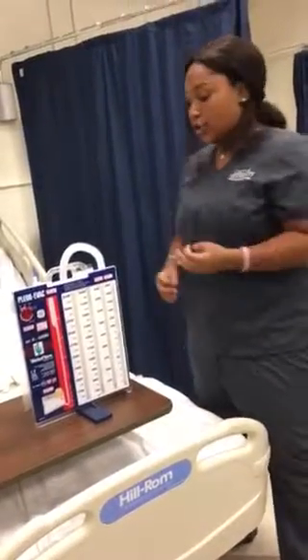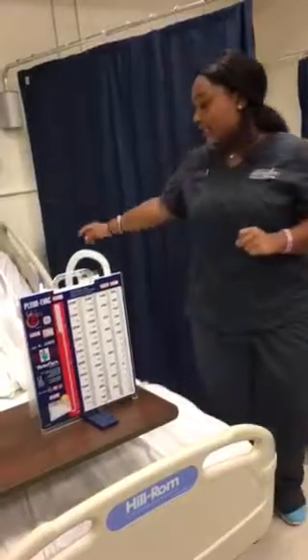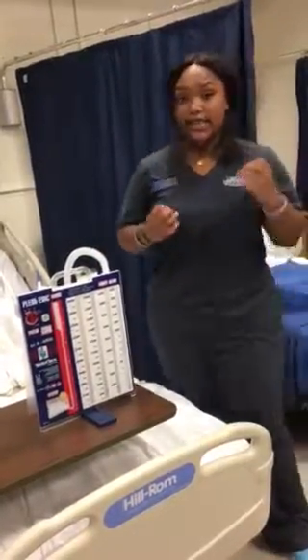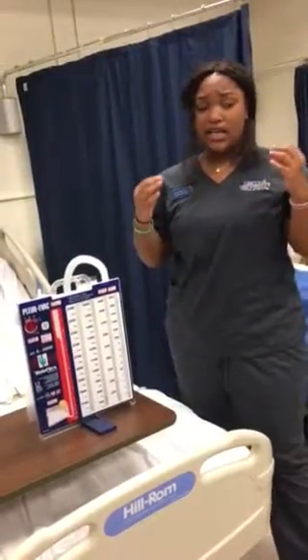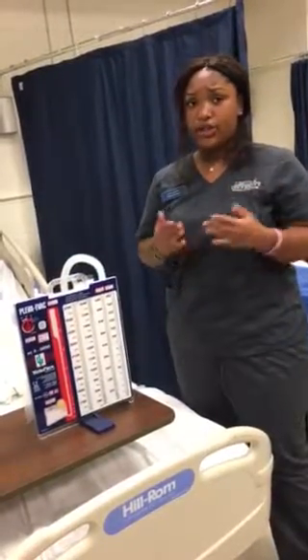And when that happens, you should check the tubing, the dressing. It could be a hole somewhere or something's just not going right, and you need to assess and take care of it. And there's a chamber for suctioning, and typically that is per doctor's orders, but if you have a doctor's order, you could adjust it, but you should just leave it up to the physician.